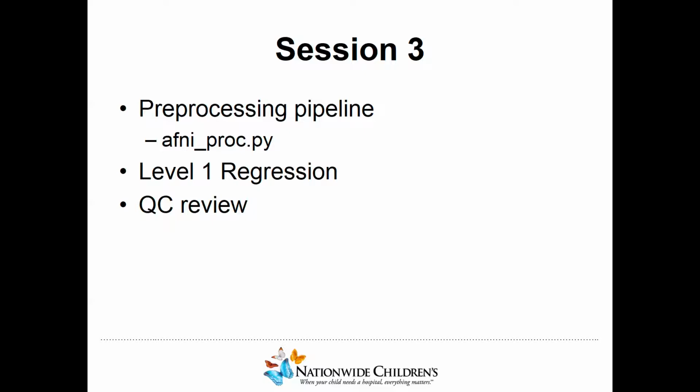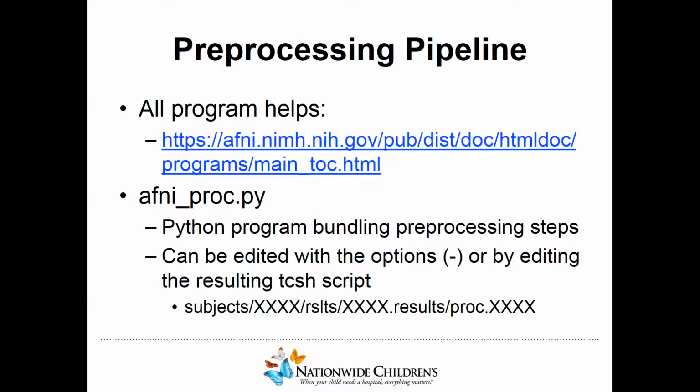The data structures themselves are very complex, and if you put them through a lot of this pre-processing, the data will look great even if it's actually not. So it's good to look at all these steps, and I definitely want to spend time on that. We'll see if we get to that in this session, but if not, session 4 will cover a lot of that. Okay.